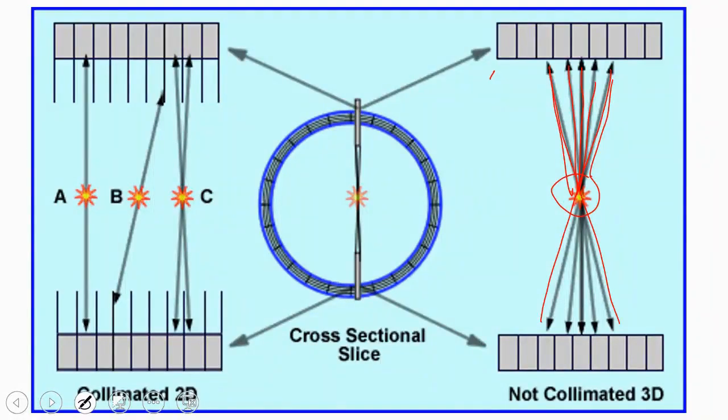180 degrees in that direction will also be received from any direction. However, it increases the chance of detecting scattered photons, which is a drawback of the 3D mode. That's why we talked last time about the concept of energy resolution and timing resolution. The energy resolution concept, through the pulse height analyzer, tells you that the scattered photon coming to me, which underwent Compton scattering, is not coming to you with 511 keV. Instead, it comes with a lower energy. Therefore, you can adjust your window so that anything coming with low energy will be rejected. This way, you achieve energy resolution.